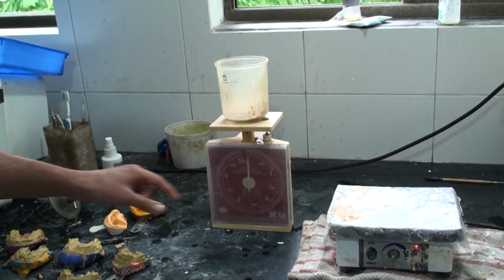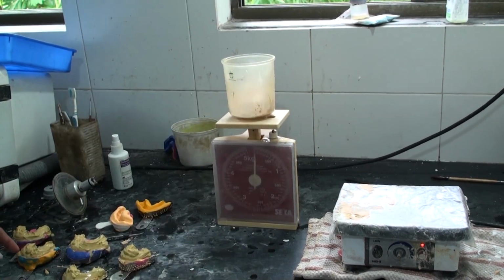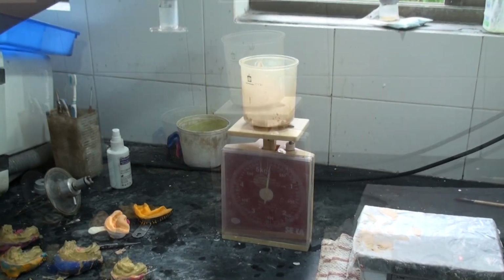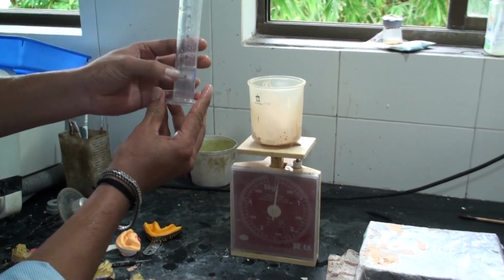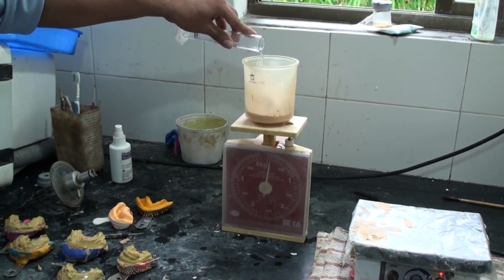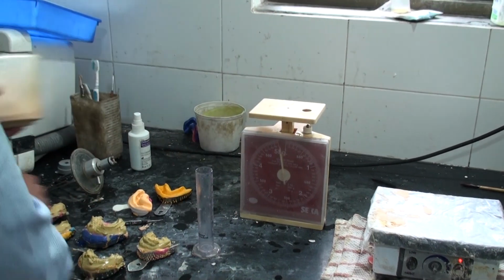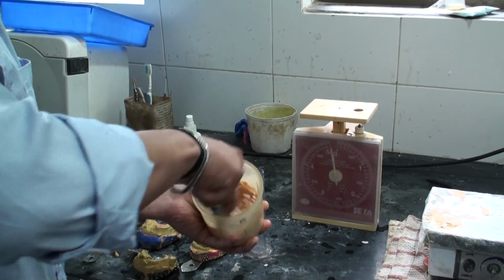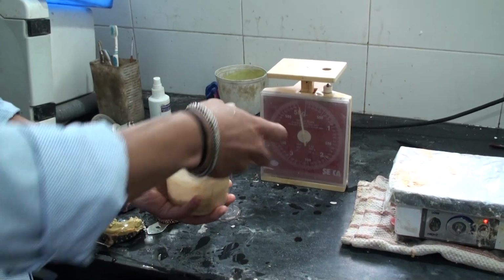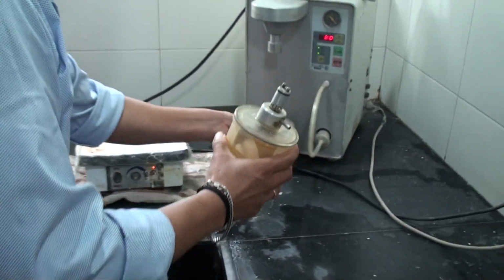So here you can see he's measuring a very precise amount of powder, adds in another increment, and then takes a very precise amount of the water as well. Places it in there slowly and starts doing a little bit of a hand mix to initiate the mixture. And once that is done, he puts it into this little mixing machine.